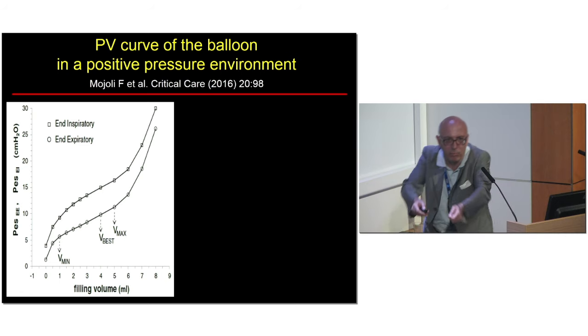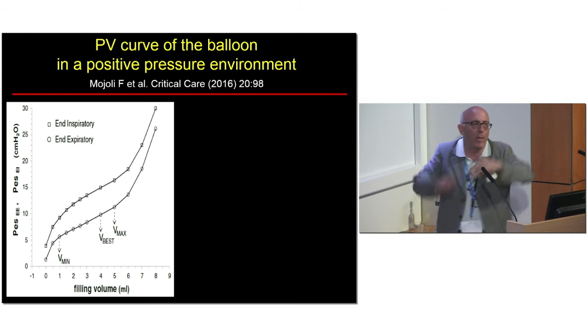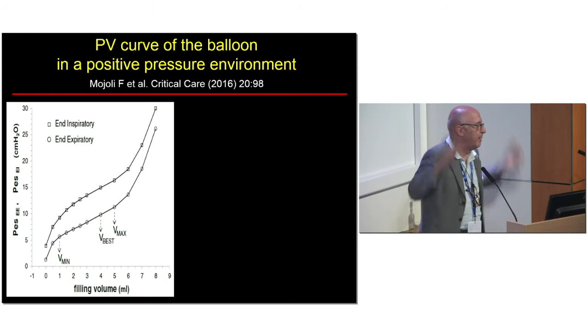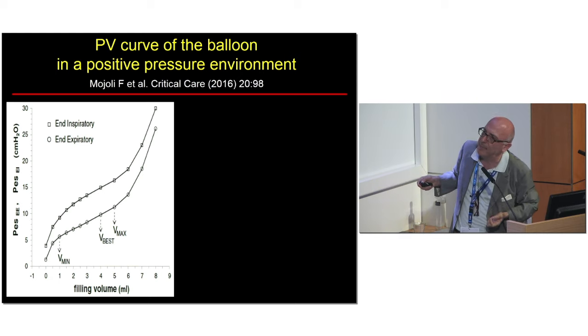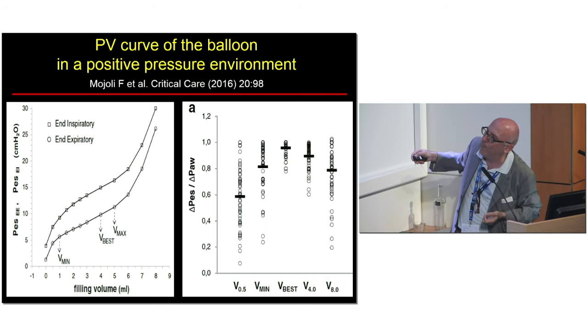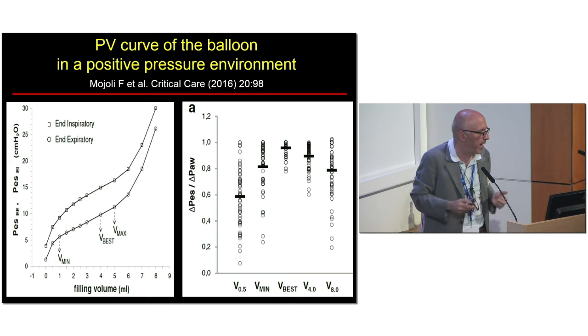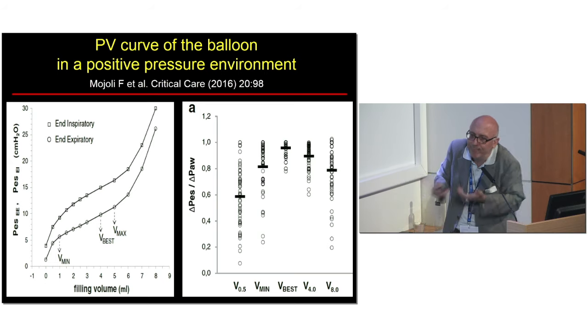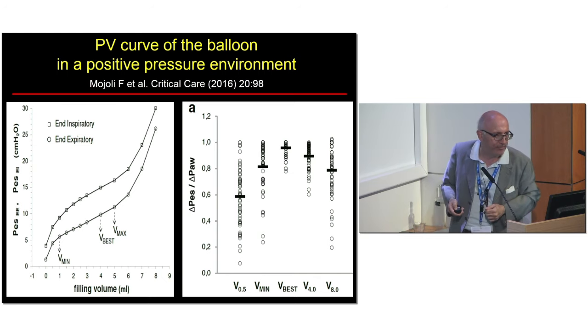It's better to measure by putting the PEEP or the pressure on the ventilator. The airway pressure is the airway pressure. Here we are talking about numbers as in a lottery, okay? They suggest going to the best volume. And in fact, they found that if you go to the best volume, the difference between esophageal pressure and airway pressure should be around 1, at the occlusion pressure. It is the best, but this means that for each balloon you have to calibrate in each patient. Very difficult, very difficult.